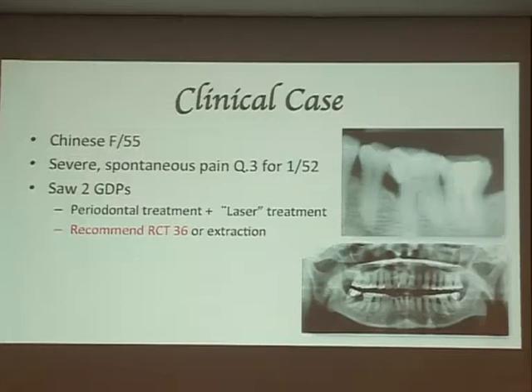Pain. So in this case, I don't think this tooth is a problem unless there's some periodontal pocket, very little pocket, some bone loss. So I do my clinical exam. I always do an X-ray. Don't believe the X-ray somebody gives you, okay? First is the quality. Second, you're not sure what was done between two X-rays taken.